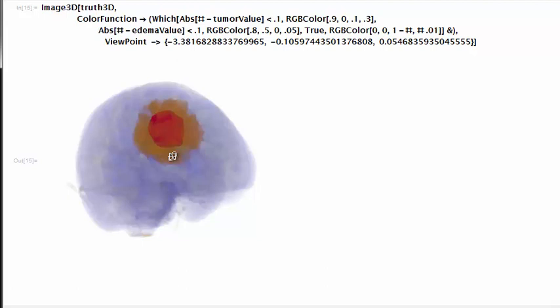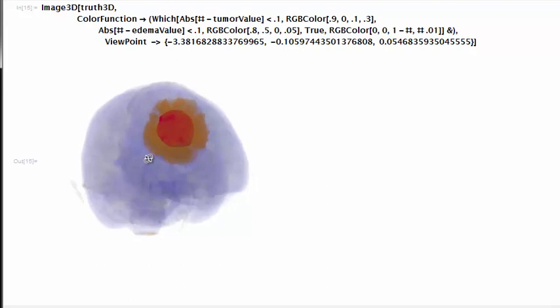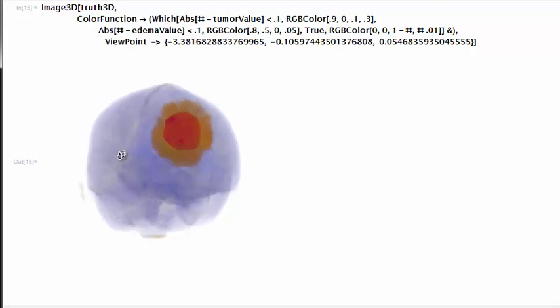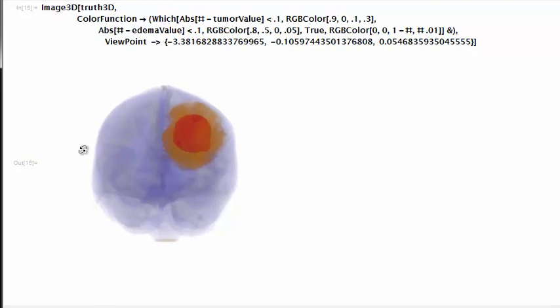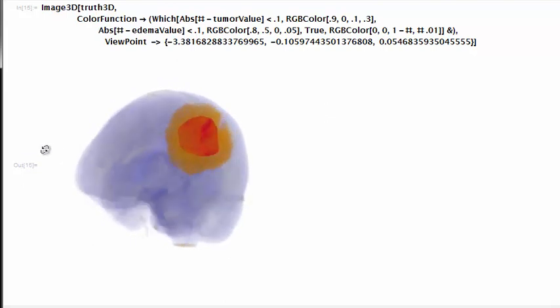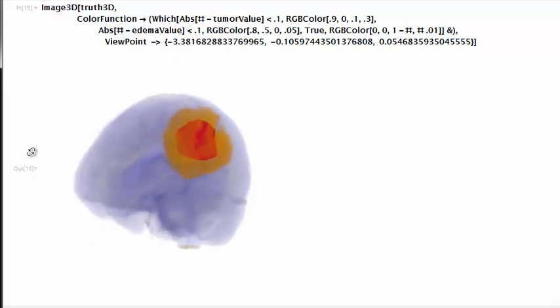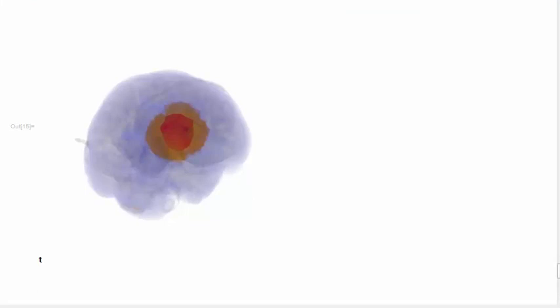And we're going to estimate the tumor's rugosity, which has been proposed as a factor to assess its malignancy. The analysis of fractality has been proposed as a reproducible computational approach to assess tumor type, malignancy, and rate of growth. We already performed qualitative exploration of a glioma. Now we're going to estimate its rugosity using box counting.